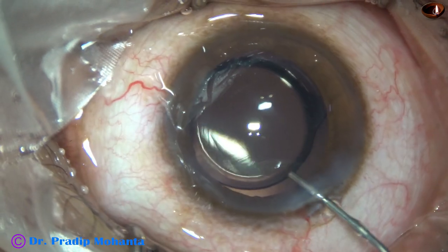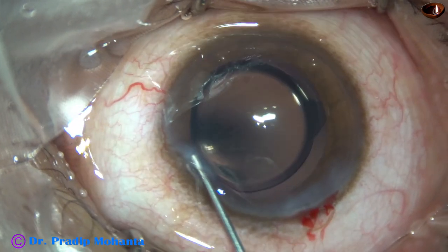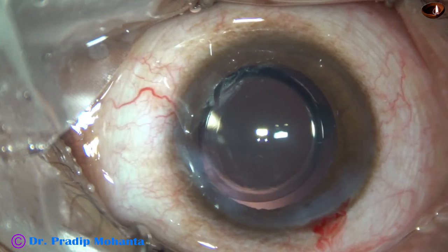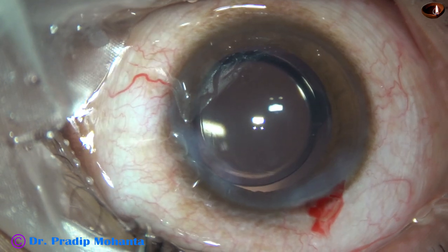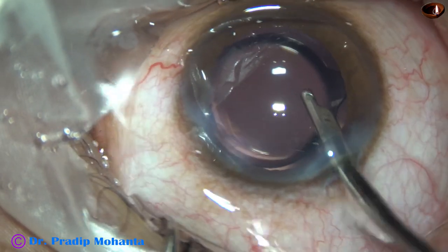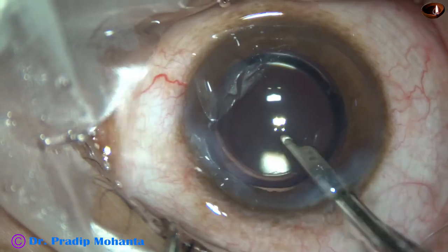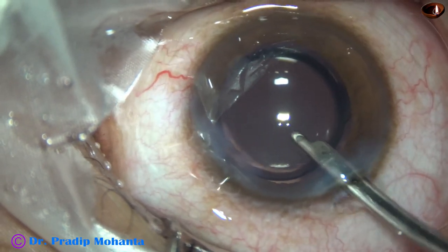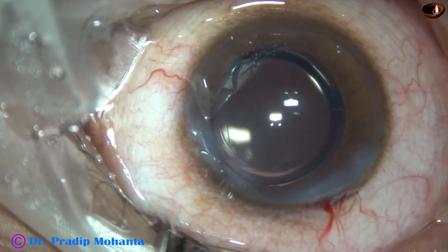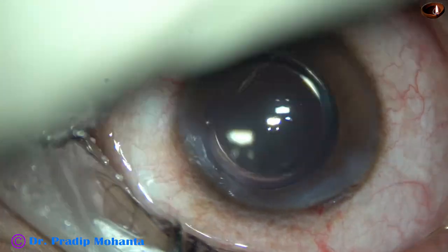This is a bit of moxifloxacin. The side port is closed by hydrating the corneal stroma on either side. And then a final lavage of the anterior chamber with the Simcoe cannula. With the Simcoe, I find it very good to form the anterior chamber — as I place it in this way, the anterior chamber forms very nicely. I find that most of the time the main wound doesn't require any hydration. See, the main wound is healed.